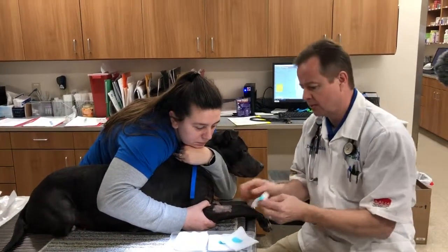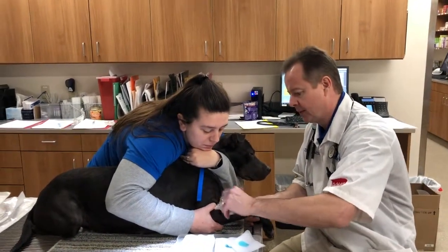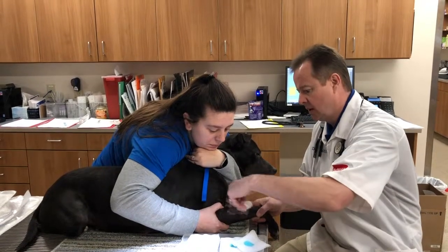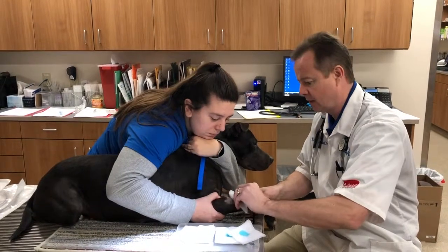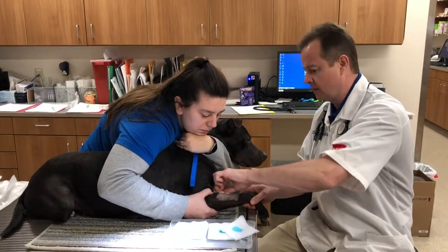I like to do at least three scrubs but I do it until they're clean. It's pretty clean. I like to focus my soap in the middle here where I'm going to place my catheter, so I'm making a very tiny sterile field.